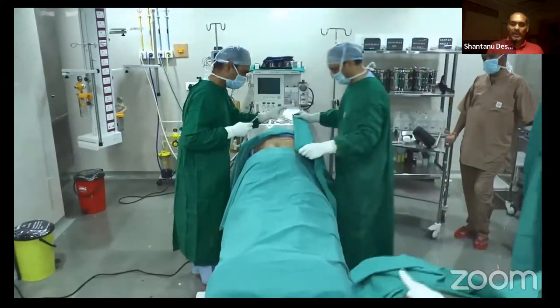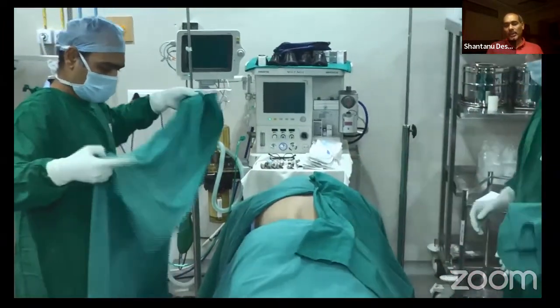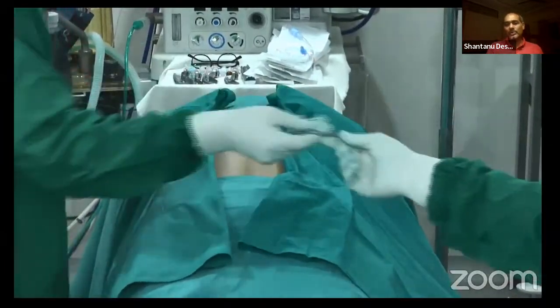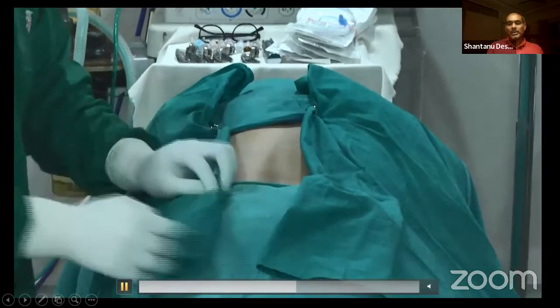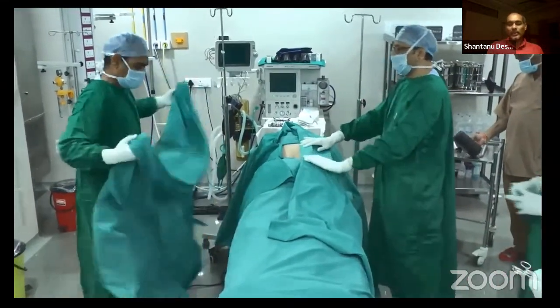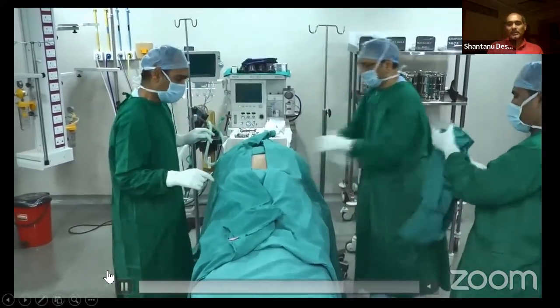So what is remaining now are the two sides. Your incision is going to be the central zone. So two sides of the body and the spine are covered with a folded big medium sheet, but making sure that the ends almost go down up to the floor, covering the entire surgical table. So once all four sides are initially draped with the single cloth drape, we used another cloth layer, giving a double isolation of the surgical area.